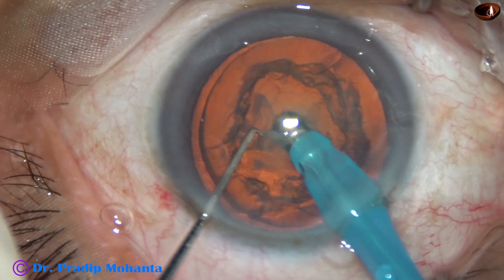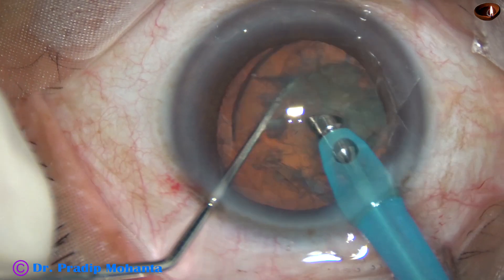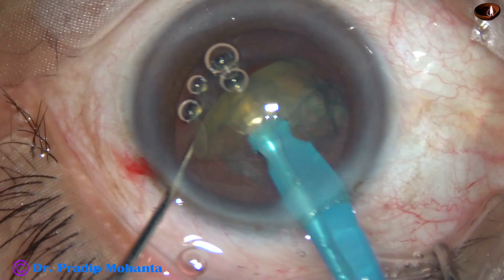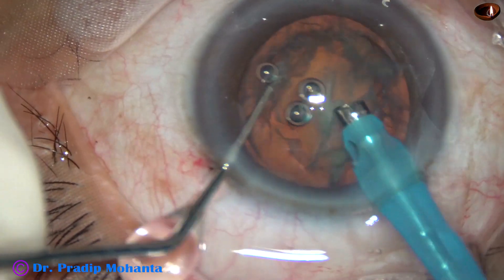In this case, I tried to chop the nucleus with bevel down. And since the nucleus was soft, it was possible. The inferior hemi nucleus is emulsified and removed.